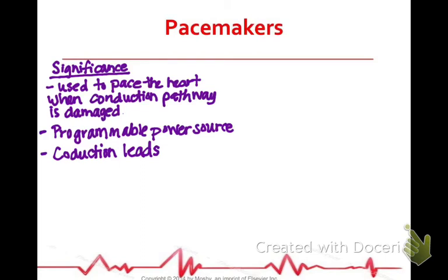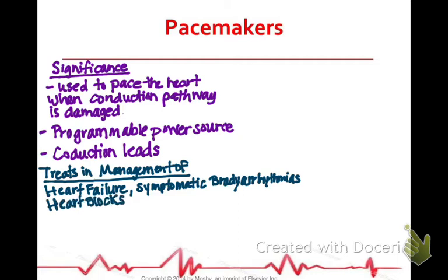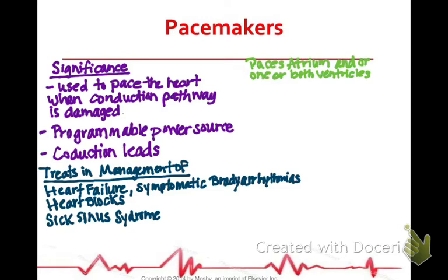The pacemakers are used to pace the heart, and the power source is programmable. A lot of times it's used to treat heart failure, symptomatic bradyarrhythmias, heart blocks, sick sinus syndrome.